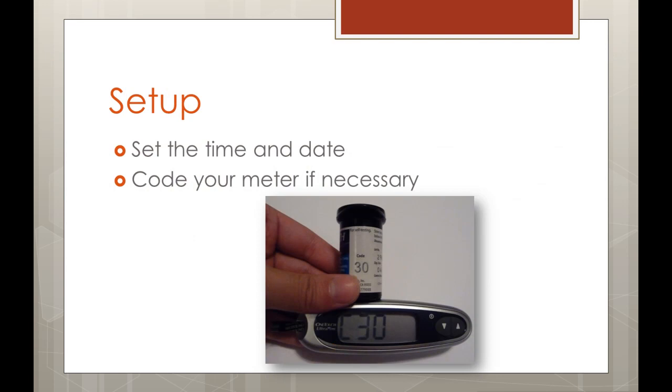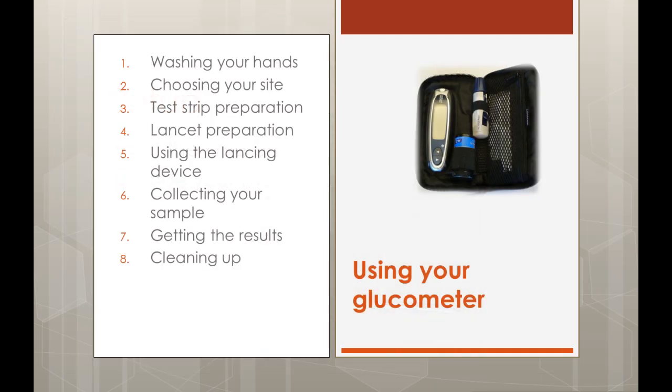First, we need to set up our glucometer. Set the time and date according to the directions in your glucometer kit. If your glucometer needs to be coded, follow the procedure outlined in your manual. Here is an example of a glucometer that needs coding, where we will want to match the code on the vial of test strips to the on-screen display. Now that the glucometer is set up, we are ready to begin testing.